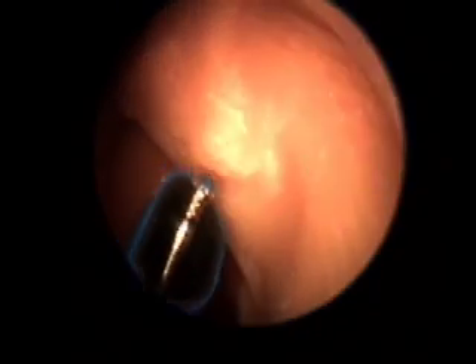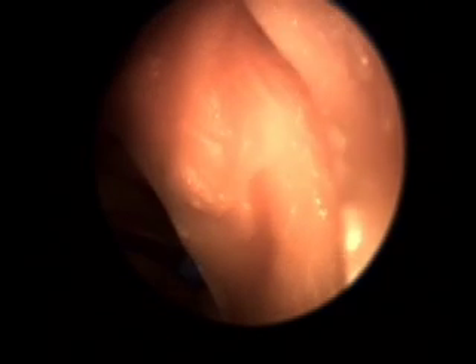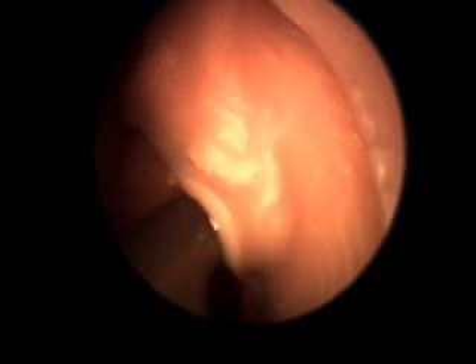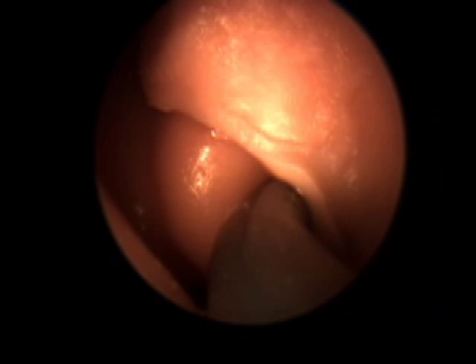Here we are in the left nasal cavity about to perform a balloon sinuplasty of the left maxillary sinus. The guide is now being positioned so that the guide wire can be threaded into the opening of the maxillary sinus cavity. The guide wire is now being passed.